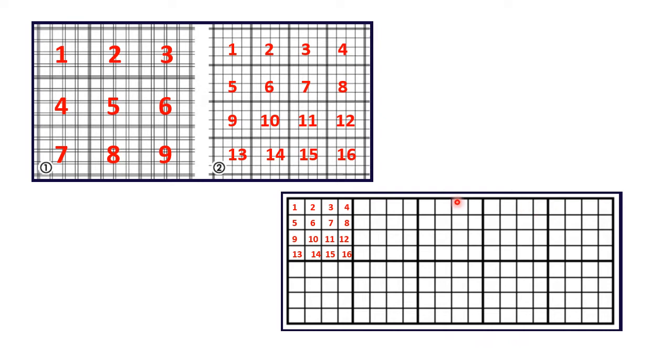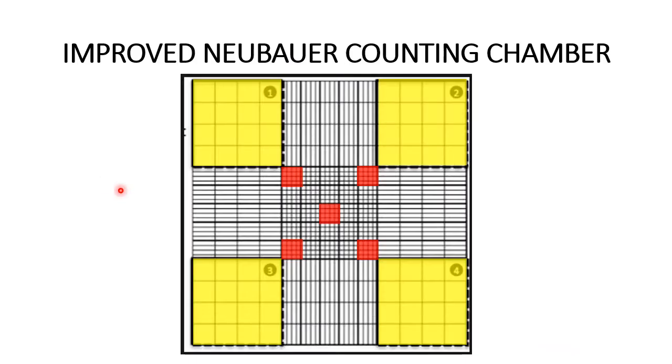Okay? Dito naman tayo sa Spears-Levy. Ilan daw ang sections ng Spears-Levy? Diba? 4. And then the area is 10 square millimeter. The depth is 0.2 millimeter. And the total number of squares ay 16. Okay, focus tayo with the improved Neubauer counting chamber. So, pag ginagamit ito, anong mga area ang ginagamit for WBC count and RBC count? Ang WBC count uses the 4 large corner squares, while the RBC count uses the central square, pero 5 small square lang ng central square. Okay?